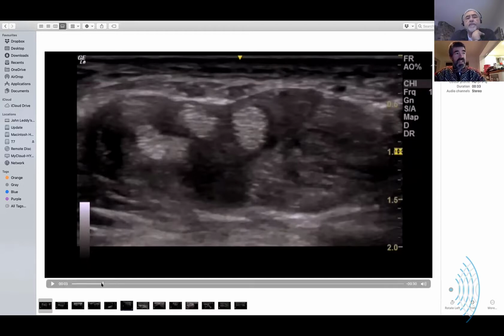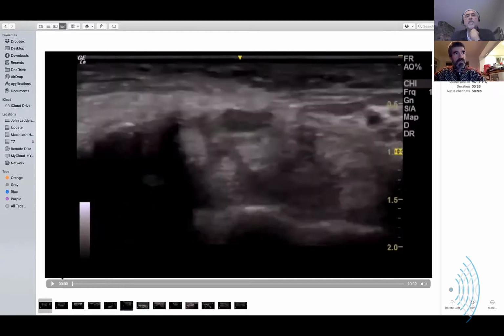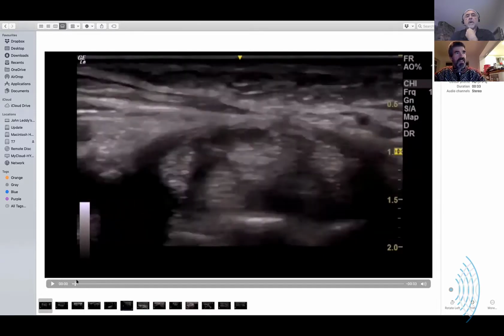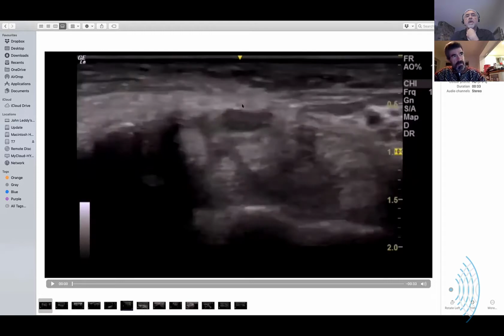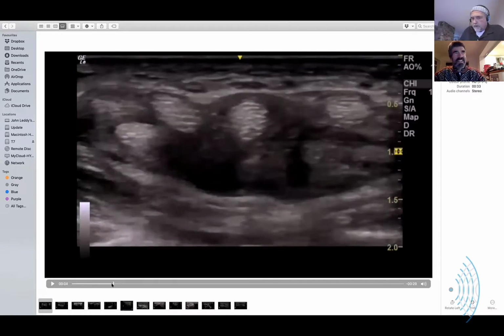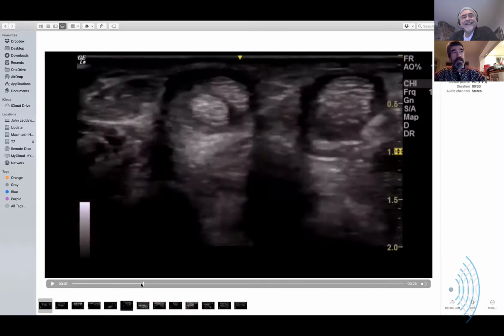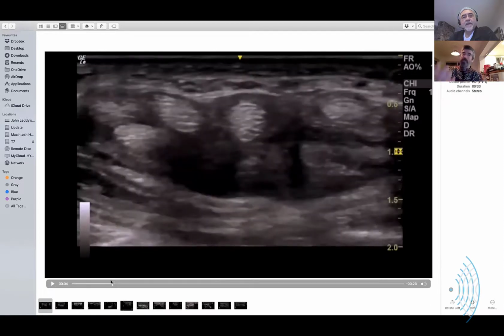And it's something that you get fooled by, because you're scanning through the carpal tunnel. You're looking at the median nerve here. And then as you go through, you remember that you're not meant to see lots of low echo once you get into the hand. But your eye won't pick it up, or my eye doesn't pick it up straight away, because I'm so used to seeing that just proximal when you're still in the muscles.